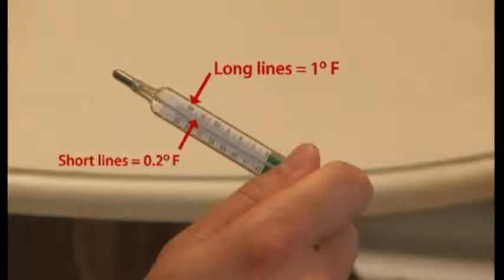Let's take some time now to look at some screens. Can you read the temperature properly on these thermometers?